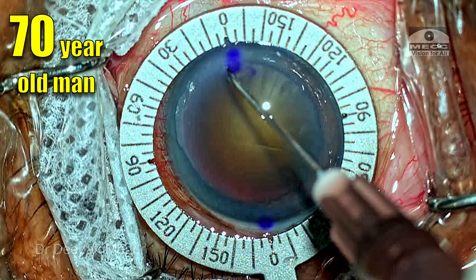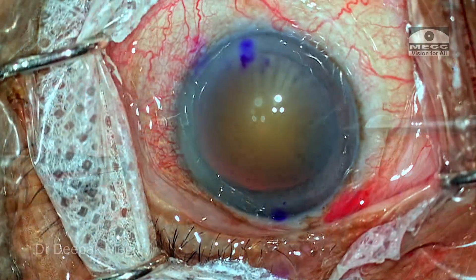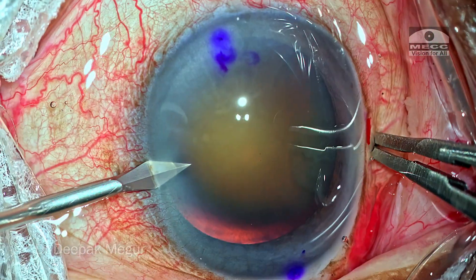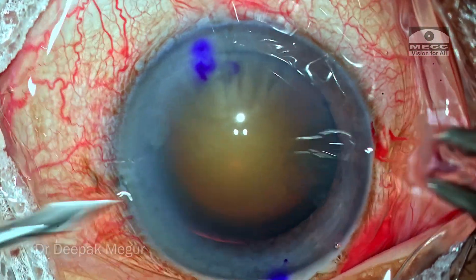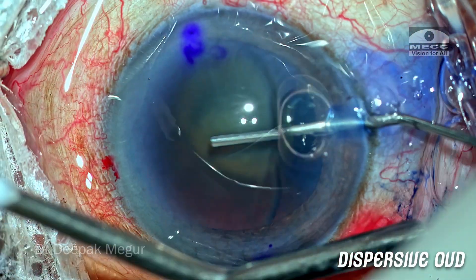This is a 70-year-old gentleman who has a brown cataract. He's scheduled for a toric intraocular lens. The markings are done, the incisions are being created, and the capsule is stained and the eye is pressurized with OVD.